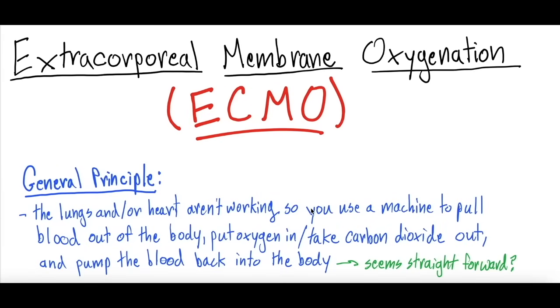Make no mistake, this is a therapy for patients that have absolutely no other option. Patients that are going to die without something more significant such as ECMO to support them while their body heals. This is not a definitive therapy, meaning it's not for someone that has no potential to heal. This is an intervention that is meant to temporize and keep someone alive while their lungs and/or heart heal enough to then maintain on their own without the ECMO circuit.